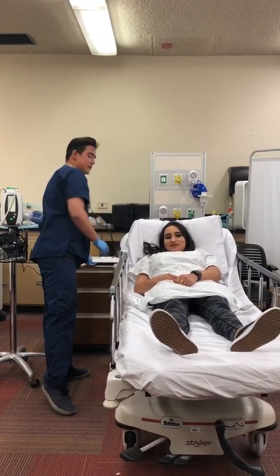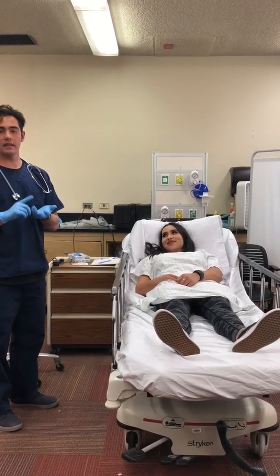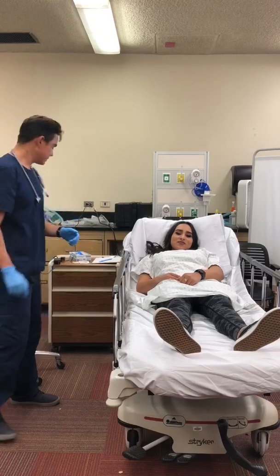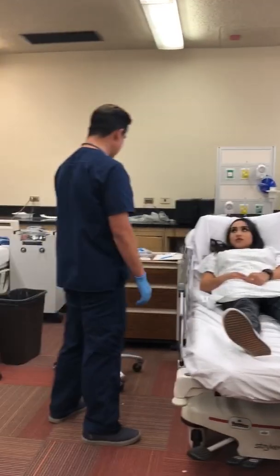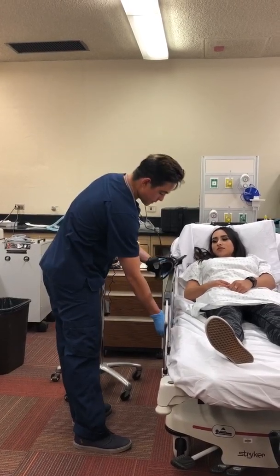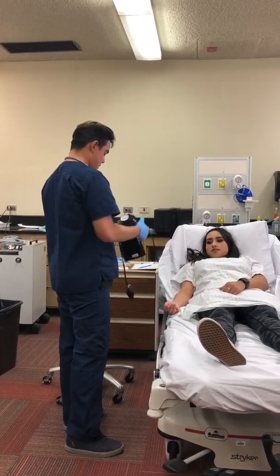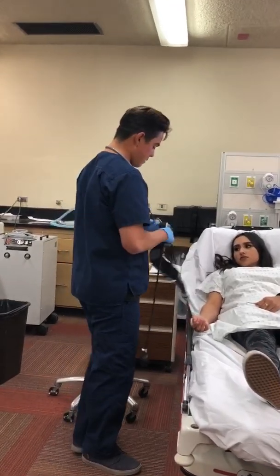After that, we're going to want to obtain a set of vitals. So we're going to do a blood pressure, heart rate, temperature, respiration rate, and pain. Start with your blood pressure. So we're going to take a blood pressure for you right now, okay? We go ahead and lower this rail. Follow your right arm.